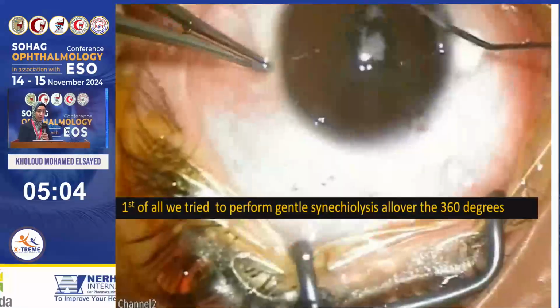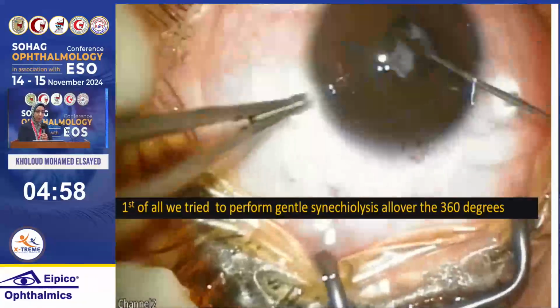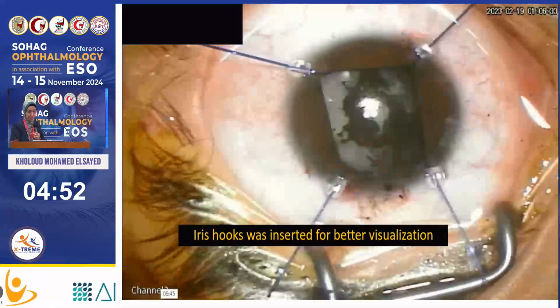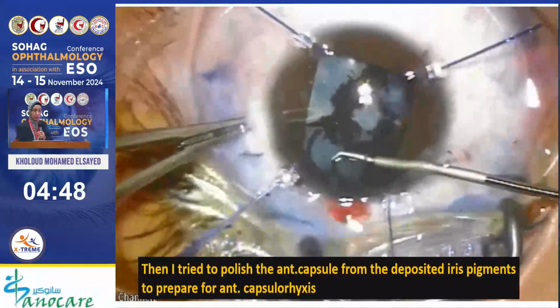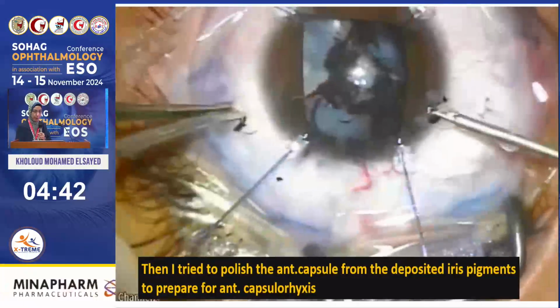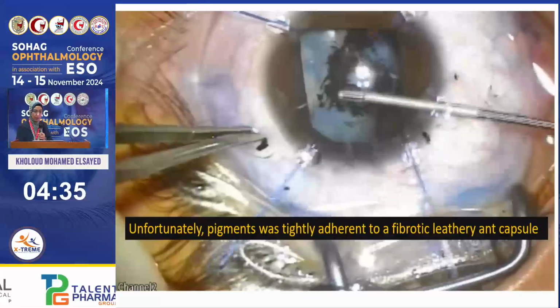First of all, I tried to perform gentle synechiolysis all over the 360 degrees. Iris hooks were inserted for better visualization. Then I tried to polish the anterior capsule from the deposited iris pigments to prepare for anterior capsulorhexis. Unfortunately, the pigments were tightly adherent to the fibrotic leathery anterior capsule.